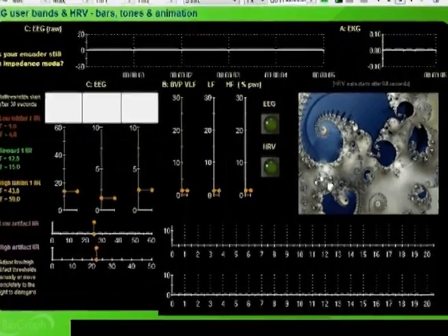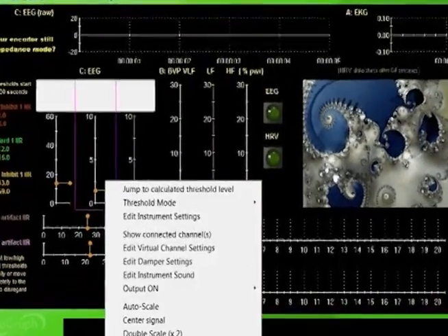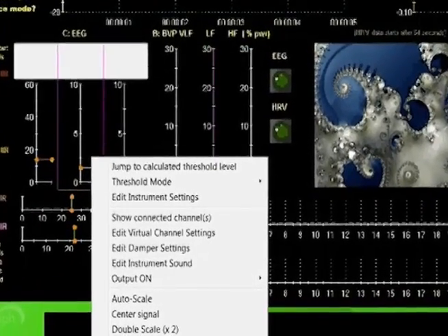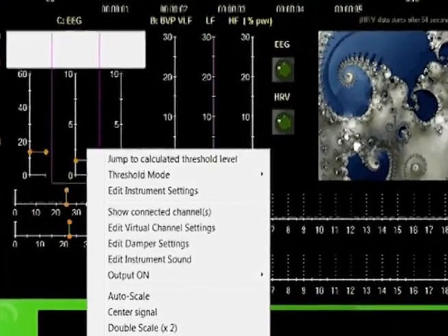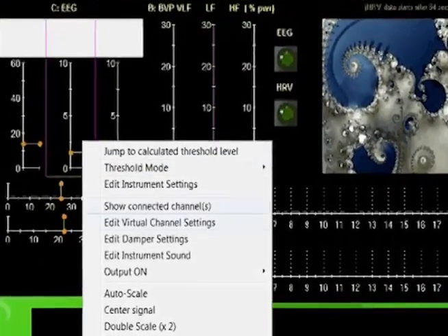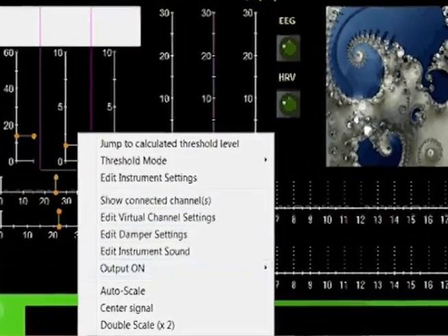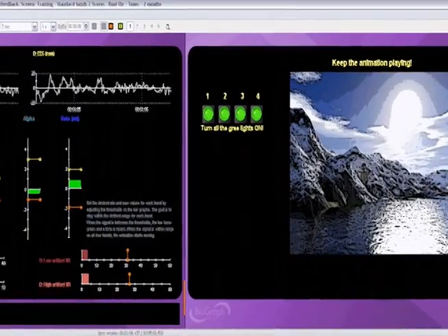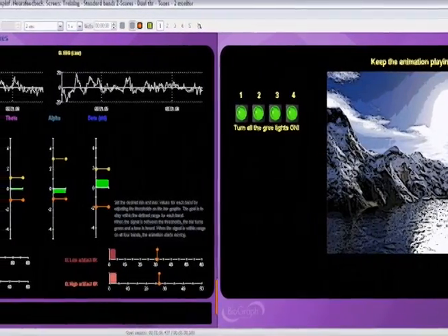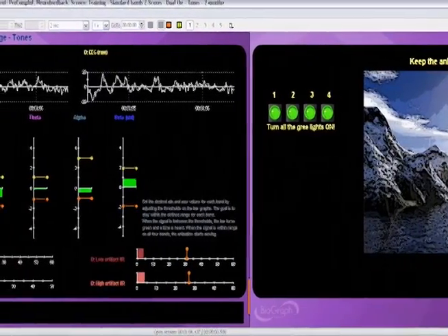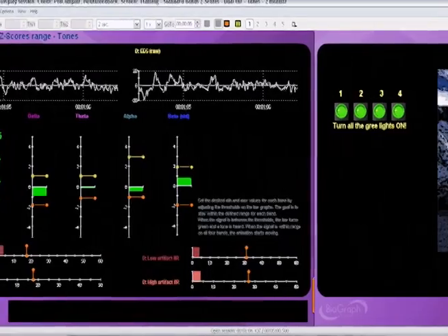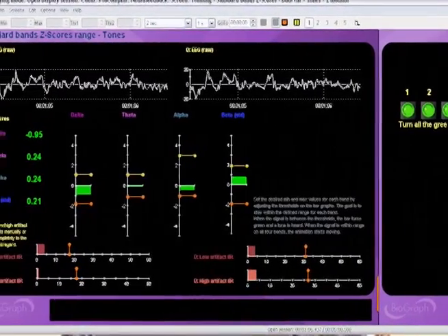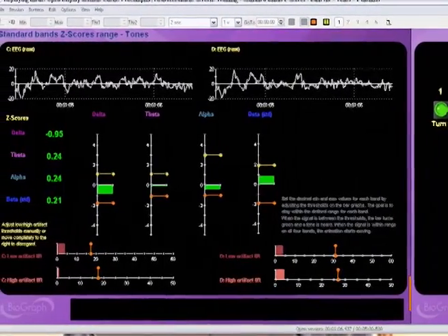Full control over treatment parameters includes auto-scaling, centering, applying predefined event markers, changing epoch times and smoothing levels, and dual screens with controls on the clinician screen which change feedback parameters on the fly, including bandpass frequencies and thresholds.